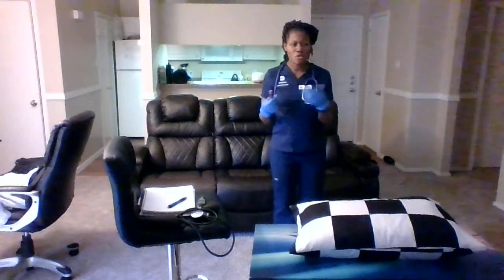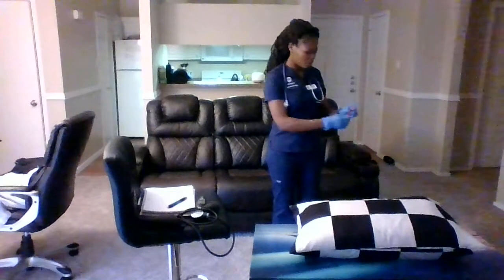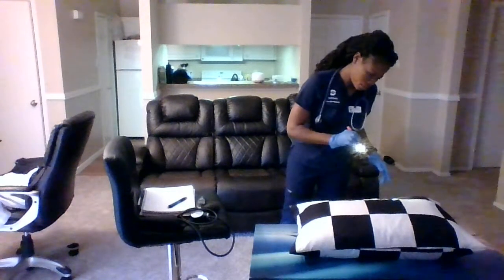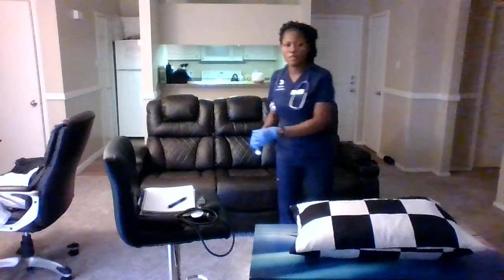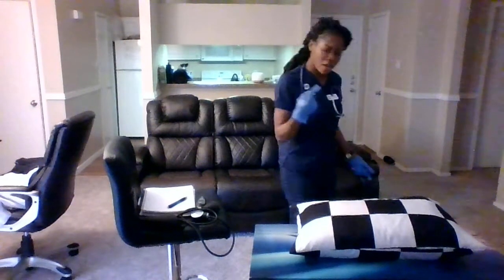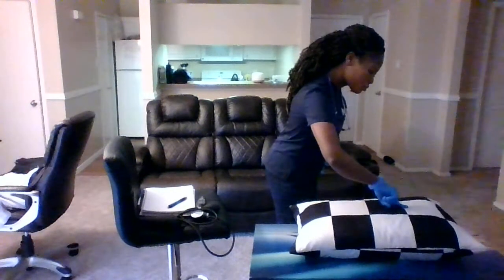So the next thing I'm going to be doing is his nose. I'll use the pen light to check if the nose is clean. No polyps. His nose is clean, and also I'll use my hand. Can you take a deep breath? Deep breath.